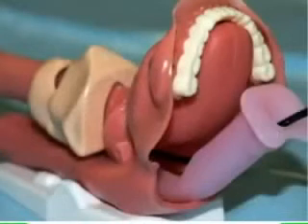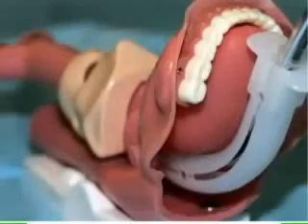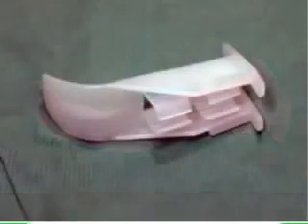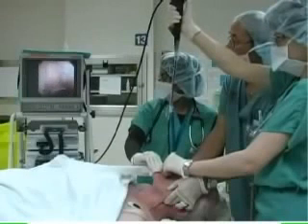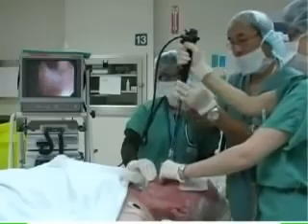Various oral intubating airways can also be used during fiberoptic intubation. These may help to keep the bronchoscope in the midline and align it with the glottic opening, displace the tongue anteriorly, and the soft palate superiorly, thus opening the pharyngeal space, and to protect the scope from bite damage. These include the Berman intubating pharyngeal airway, the Williams airway intubator, and the Ovassapian fiberoptic intubating airway. While these airway intubators may be helpful, the emphasis should be on the development of skill with bronchoscopic manipulation, positioning, and regional anesthesia of the airway.